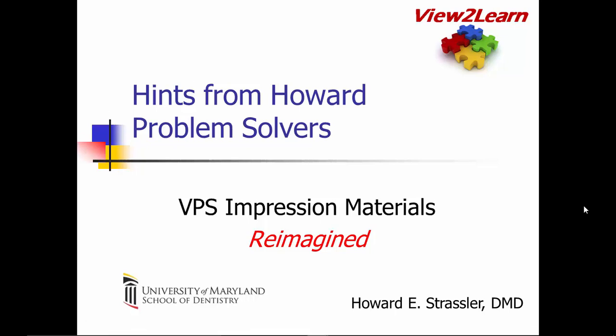This is Dr. Howard Strassler with Hints from Howard, some restorative problem solvers. And today we're going to be looking at VPS impression materials. We're going to reimagine them, so that they're more than just making impressions for our restorations, but that there are other uses that we can have for these materials.